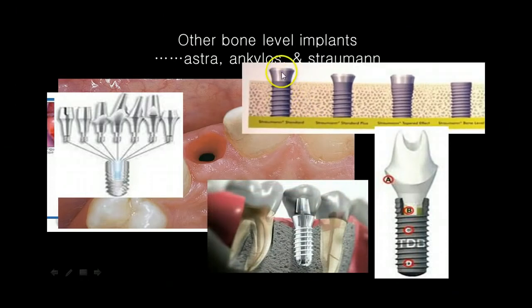You can see this is a Straumann sort of history. This is a 2.8 collared implant to try during their research days regarding the biologic width. They said, well, let's have a 2.8 collared implant, and tried that one, and it came out well. The problem is this 2.8 collar, you had to actually sink the implant deeper than sometimes the tissue that you had. So this tissue level implant here, sometimes the collar would be sticking out, so they went to a 1.8 collared implant. But again, you have a Morse taper, 8-degree Morse taper here.